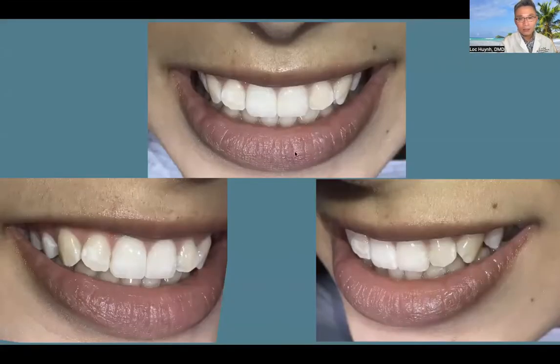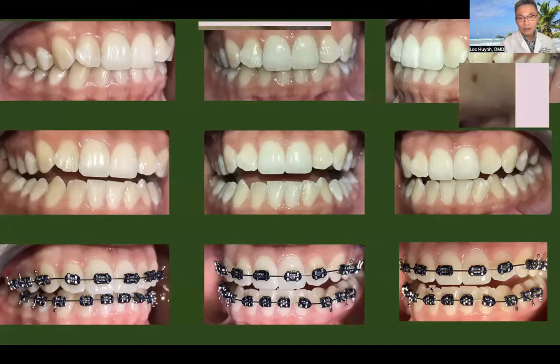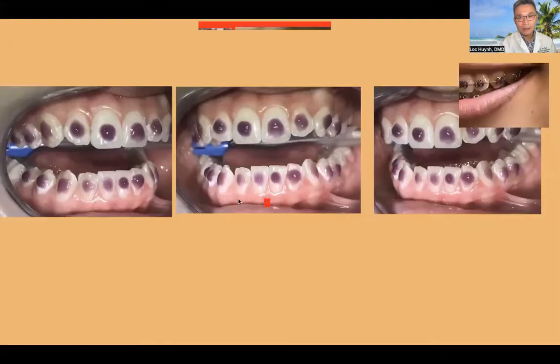Look at this one. You know, pretty nice. If you just clean your patient's teeth and let them go home, no problem. But I just showed you the problem. When people smile like that, it seems like there's no problem, right? But when you look at the situation, you see the problem that we could improve. Enamel wearing on the bottom teeth and canine wear and tear, slowly but surely, there is a problem. So what we do, we put braces on and straighten these bottom teeth out, and you can see the improvement. This is before: etch and bond, put brackets on.